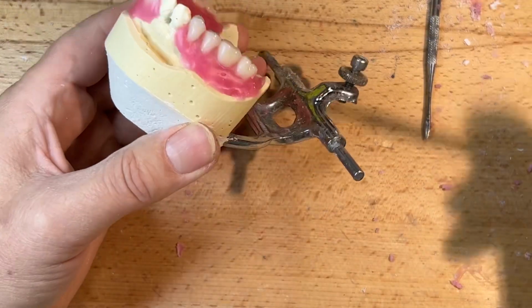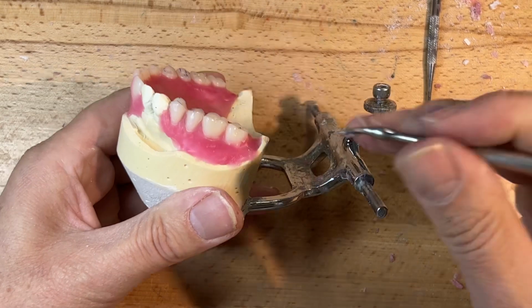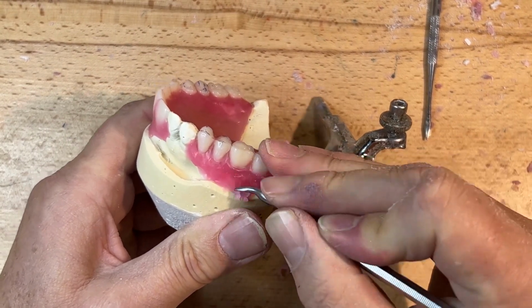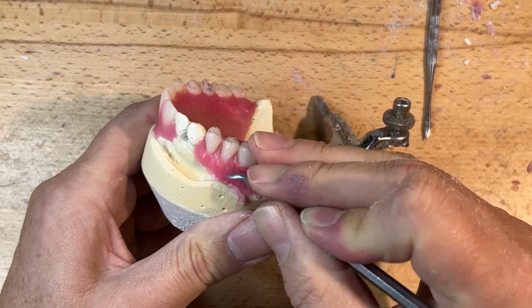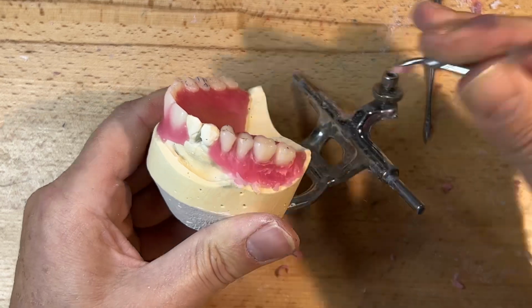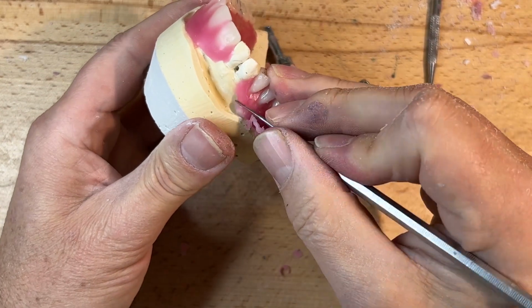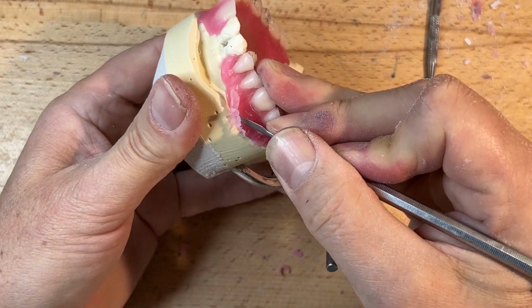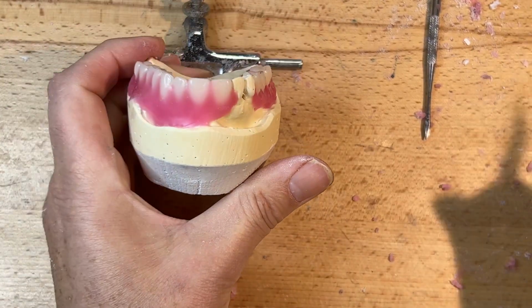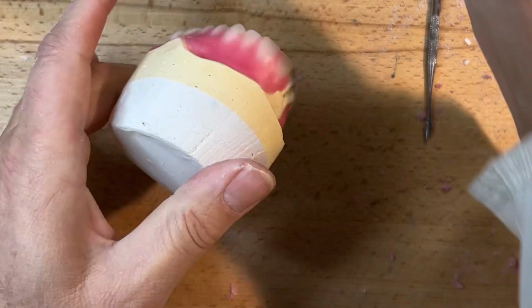Now, this is just my first run through of exposing the denture teeth. I didn't put too much wax on the teeth, but I did have enough to remove. I'll reduce the flange slightly there. Take some excess off. And I'll get back to that in a bit. That's a good start.